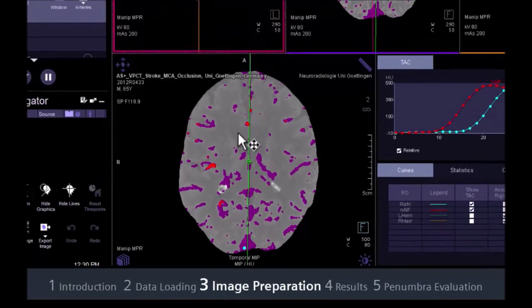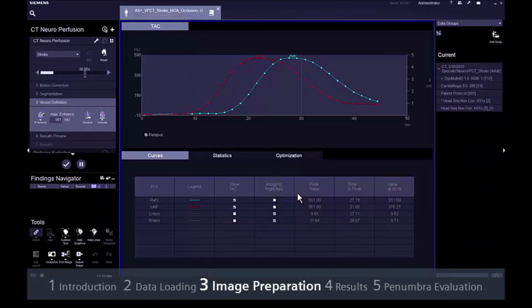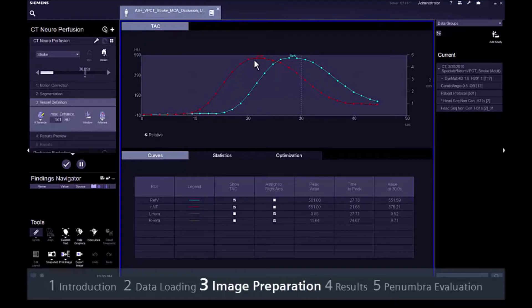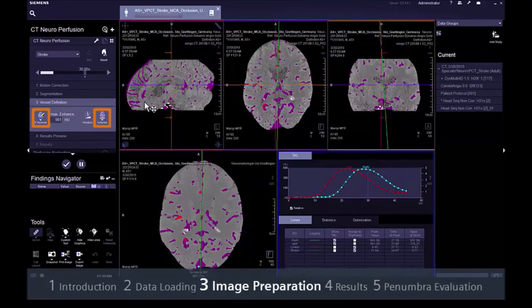Just verify that the detection is correct. Time attenuation curves will help to determine if they are plausible. The peak of the red arterial curve should lie in front of the peaks of the blue venous curve. If any curves are not satisfactory, they can possibly be improved by manual definition.